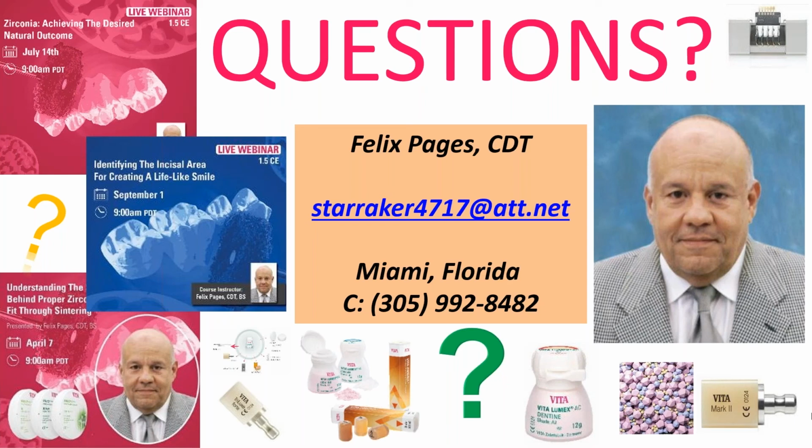I could help you a lot more if the margin's really thick. If the cervical area is really thick and you can't take it down anymore, then you've got to use a zirconia that looks like that cervical color, or use white zirconia and paint it with the dyes. That's what John Bilikowski does. You can't even tell which teeth are there with all those colors in it.